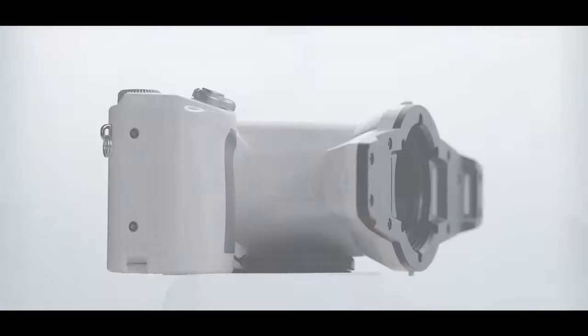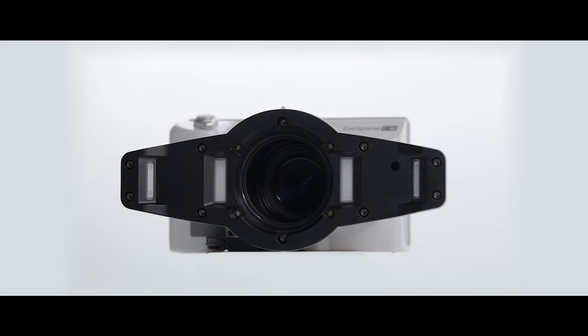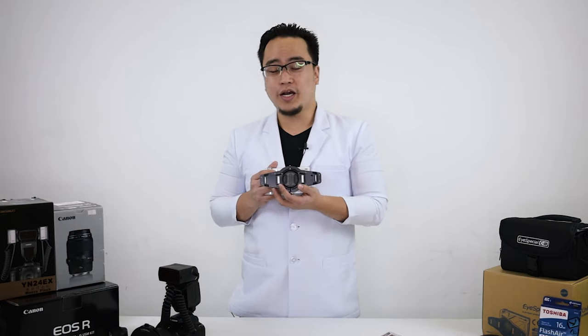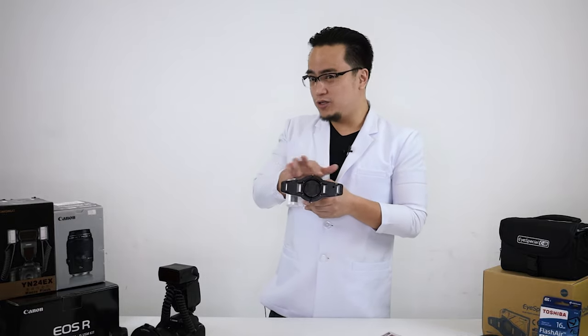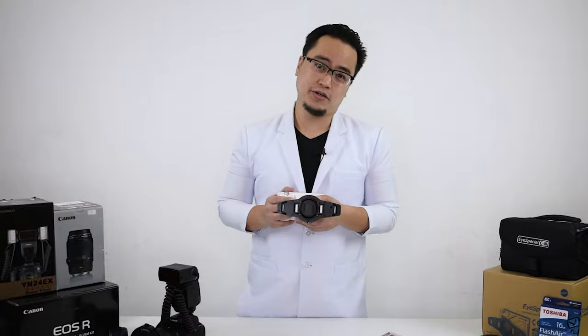On the more technical side, this has a built-in twin flash and somewhat of a ring flash in the middle, which is great for intraoral and anterior photos because you really need to switch between those two to get better accuracy and better results.